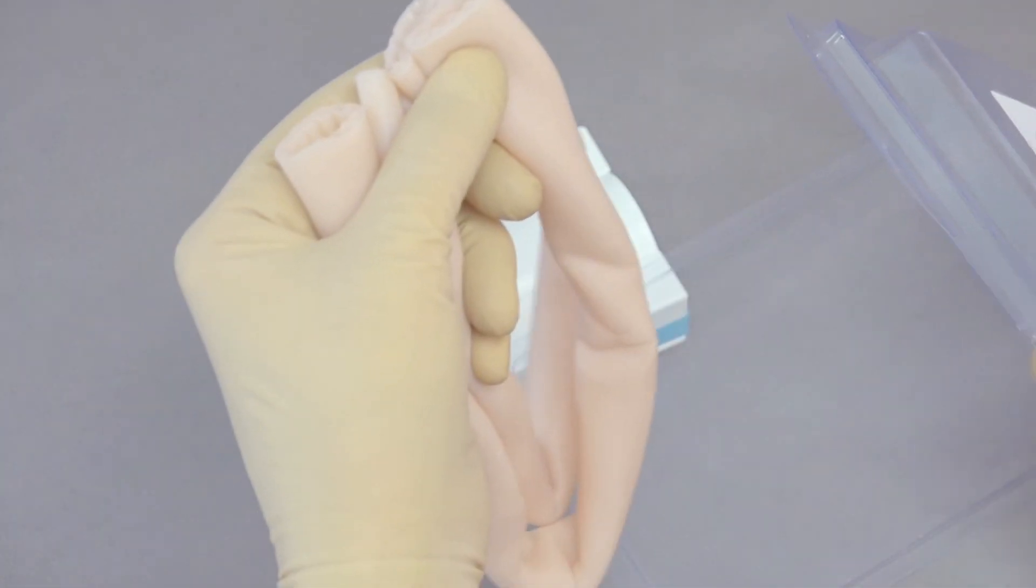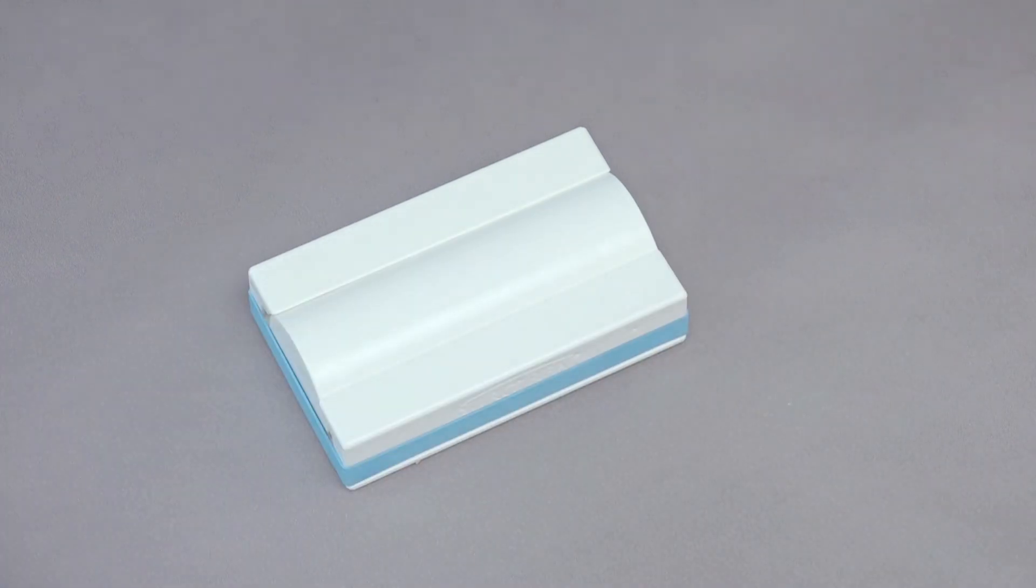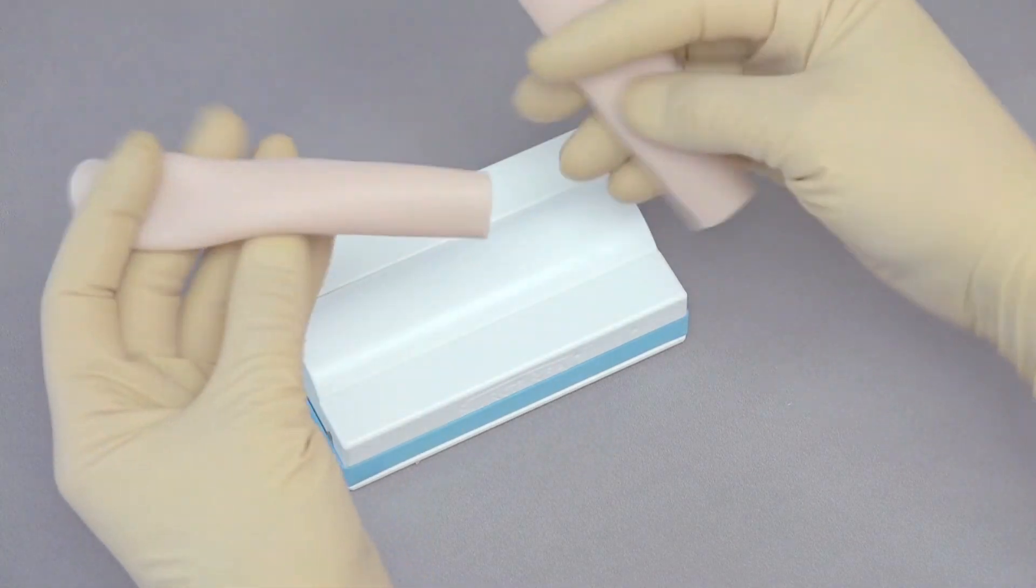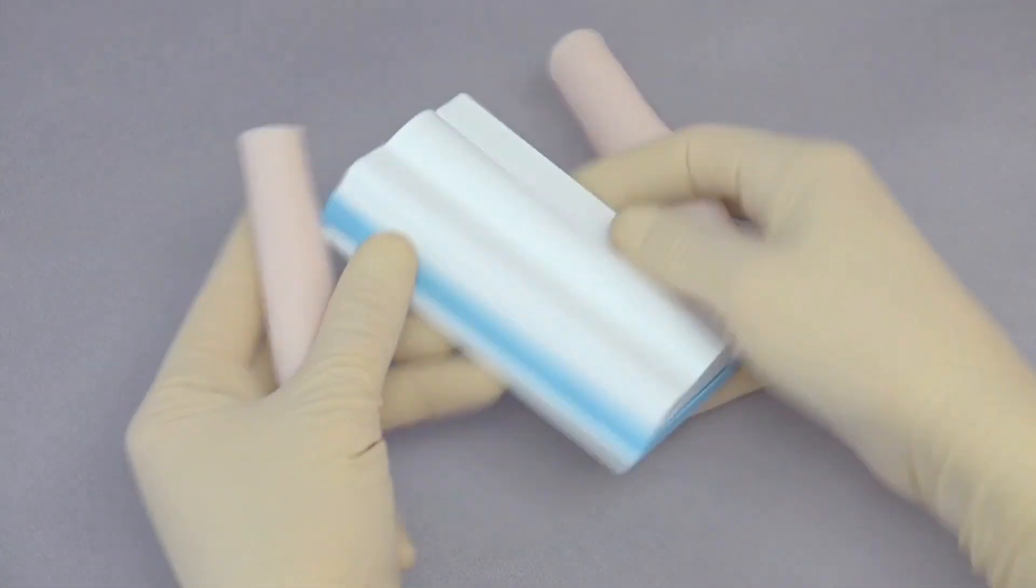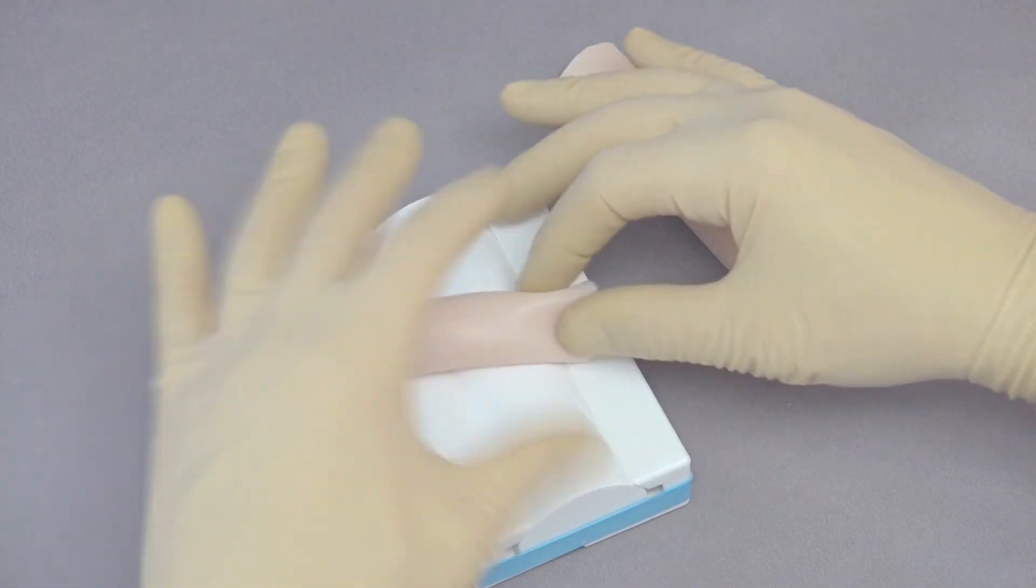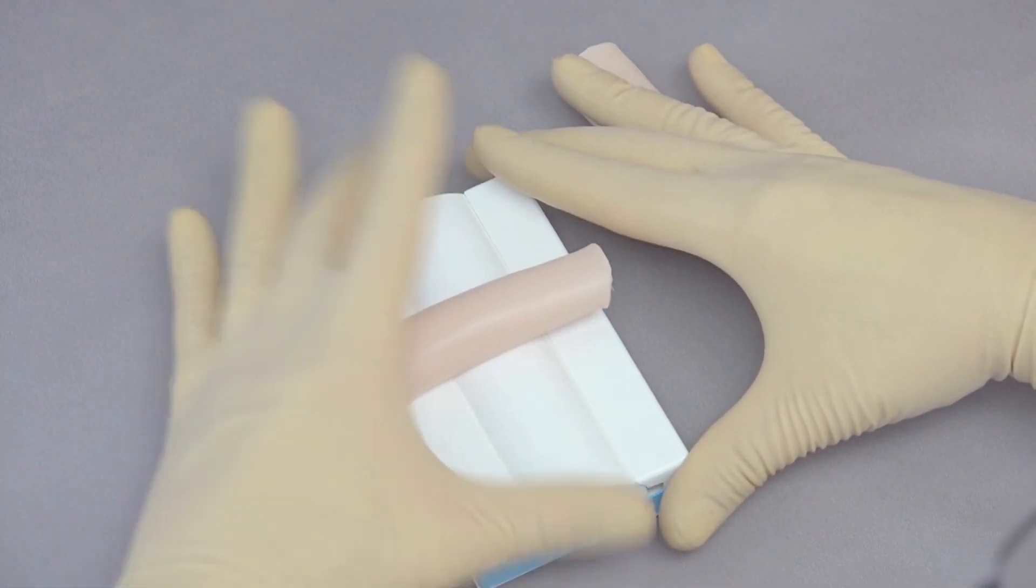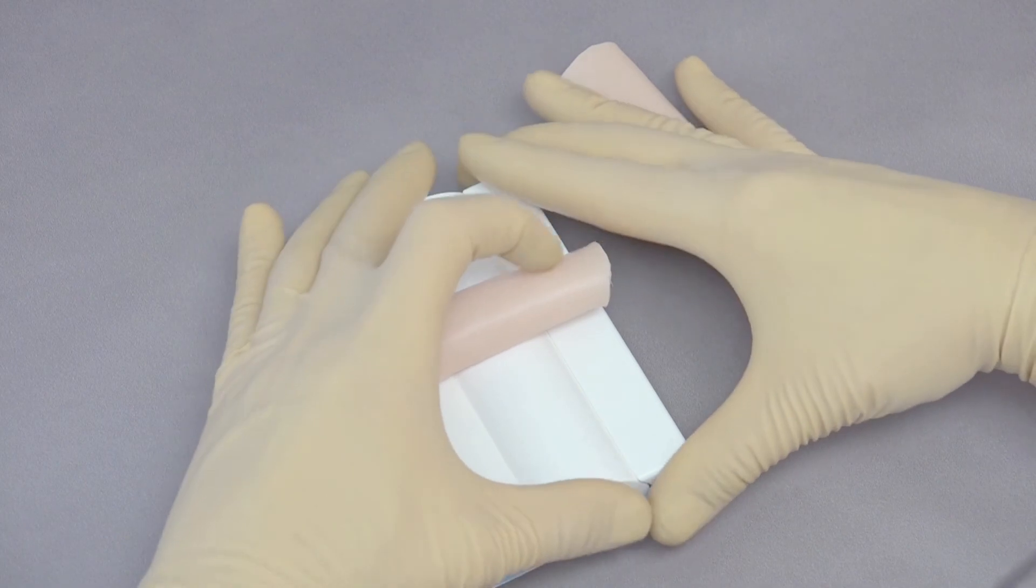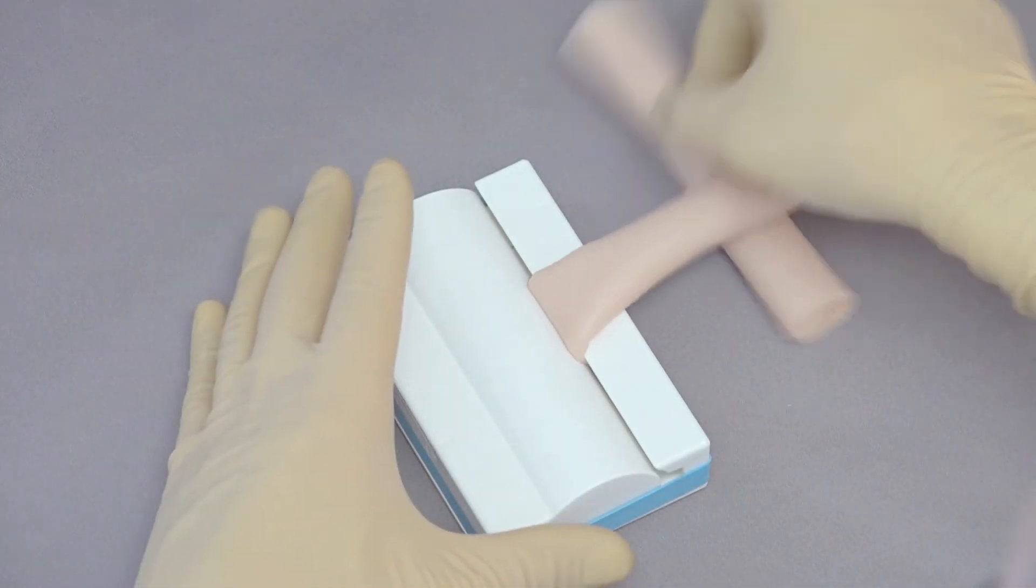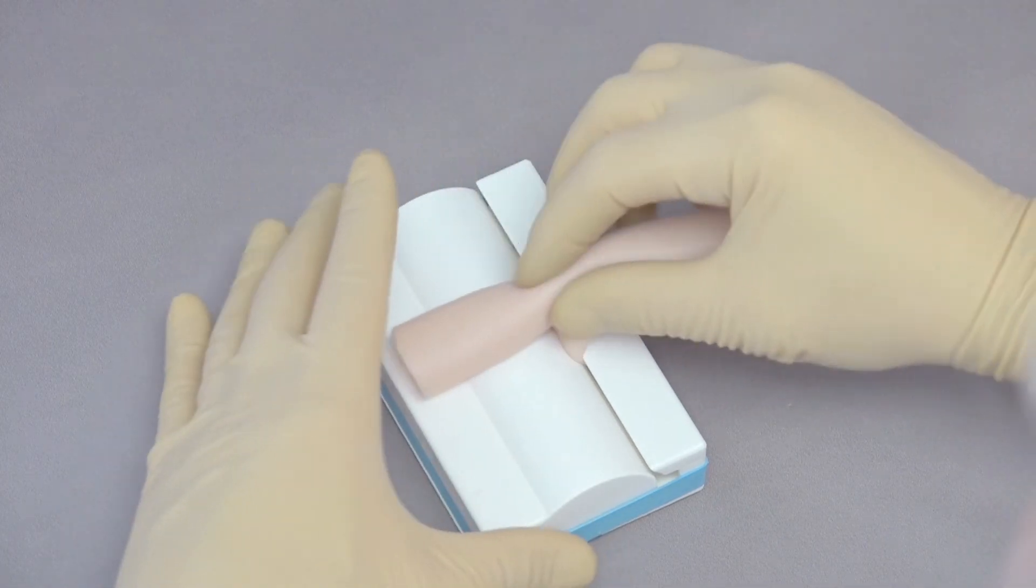So what I typically do with these is actually cut those in half and then I have two pieces of intestine. I can also use the Surgery Real Tensioning Base. I can open this up by holding with my left hand, pushing the intestine in there, pulling that to the side, opening now.